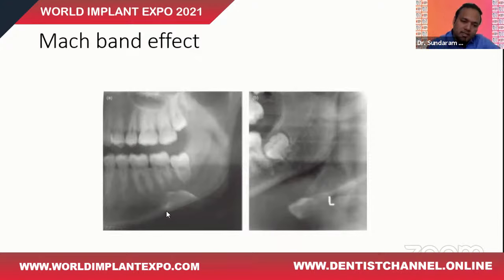If you would see this X-ray, you can see one radiopaque image lying over here towards the lower border of the mandible. And this varies in density, and the body of the mandible varies in density, and it appears as though there is a difference in the densities between the two structures. And this actually at different angulation would reveal that it's only the hyoid bone that is interfering. So the Mach band actually arises within the retina and results from the physiological process of lateral inhibition.